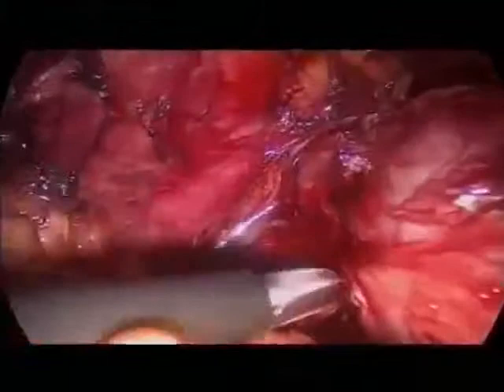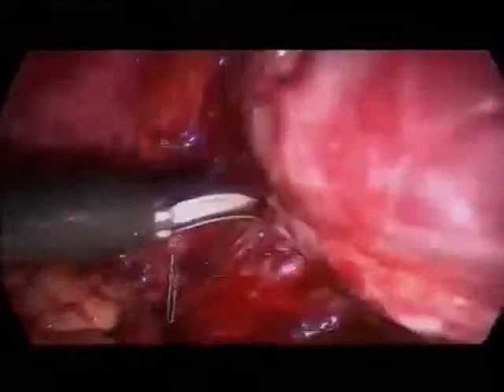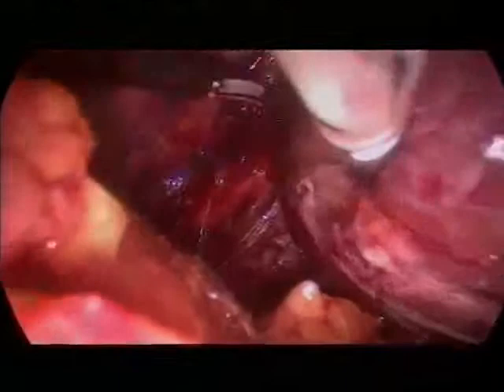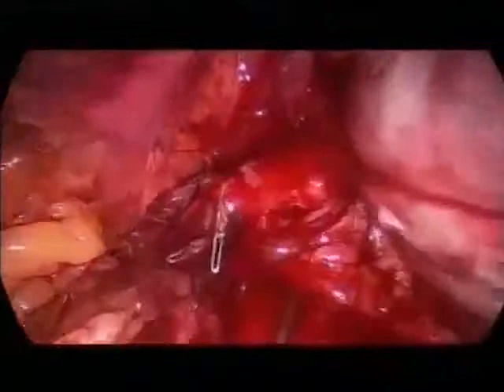Can you come under the prostate, please? Okay, you see here, this is the nerve structures. And if we would cut from ventrally, there's a high risk for injury of these structures. For this reason, we do the final dissection from posterior lateral. Is that understandable? You see that? Yes.